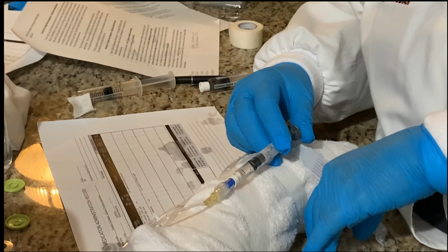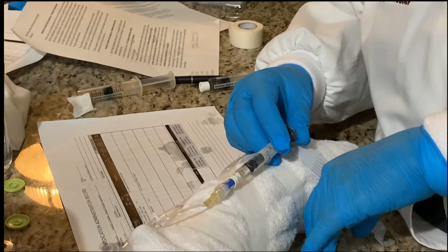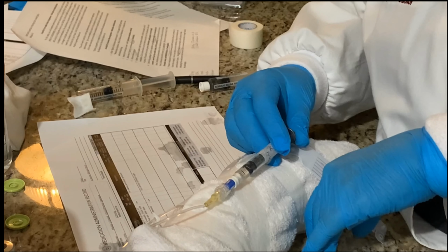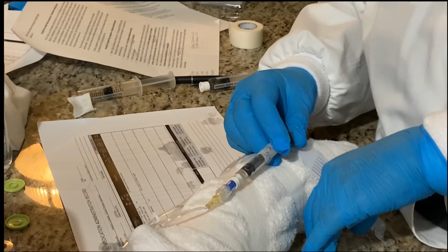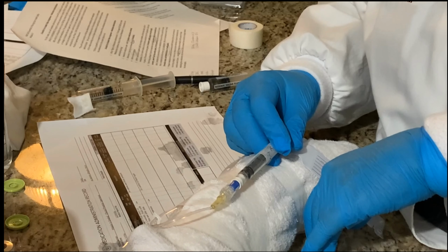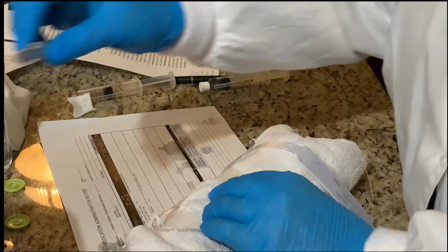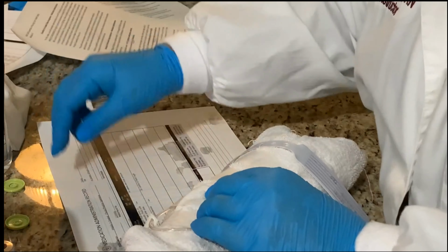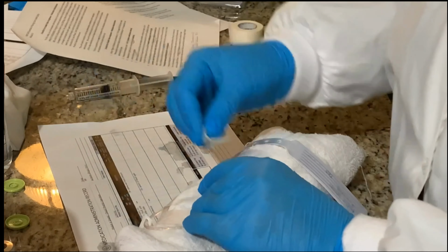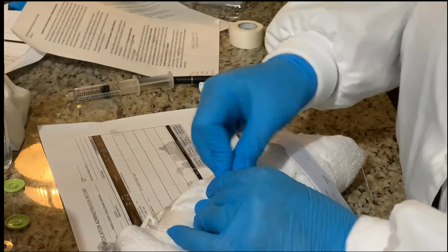So because of the time, of course, on your video, I need to see you do this over 2 minutes, but I'm going a little faster here so that we can get through the video, okay? So I'm giving it slowly, and if I were a student, I actually use 2 minutes of time. And once I finish with that, I'm going to remove my syringe, put it in the needle box, get a new alcohol swab, scrub it again, 5 to 15 seconds, and now I've got my second flush.